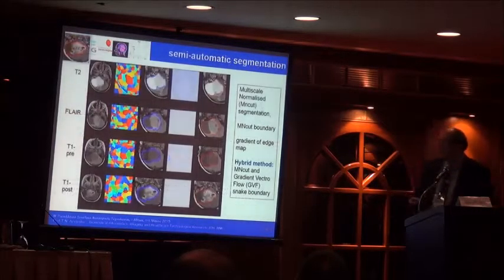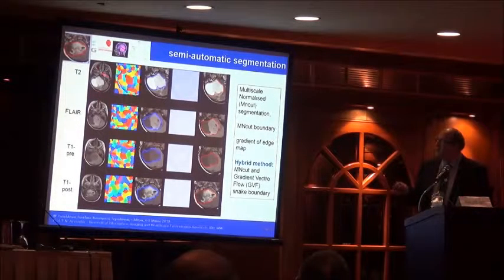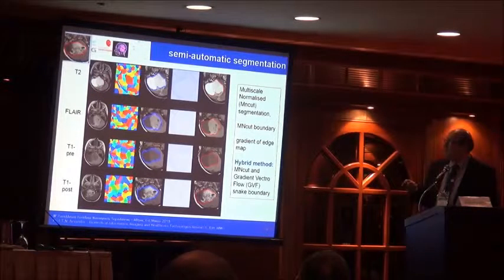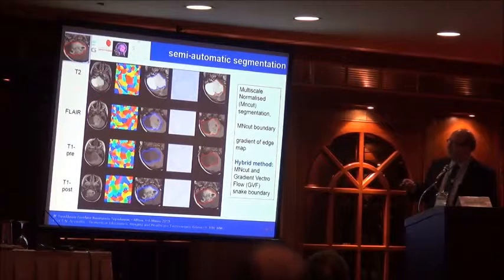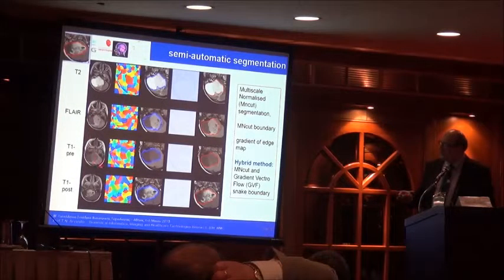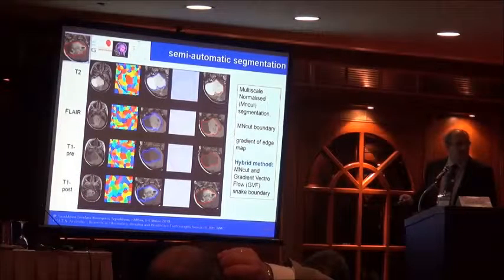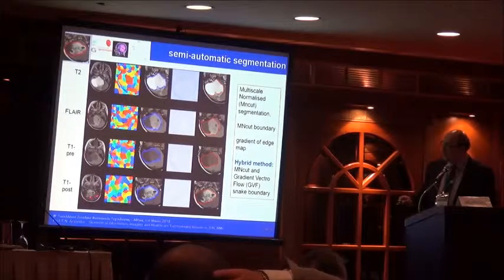So the first part of the pipeline is to find ways to segment these tumors. And depending on your technique, and depending on the tumor, you might be able to discern the tumor very nicely. Like in this case, I think this is again a pilocytic astrocytoma. In the T2 image, you can see it very well, where it has the compartments. Different techniques, different modalities show you different things. For example, the T1 post-contrast shows you that it has necrotic areas.